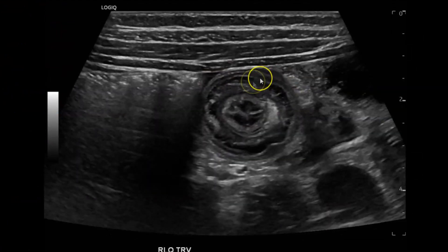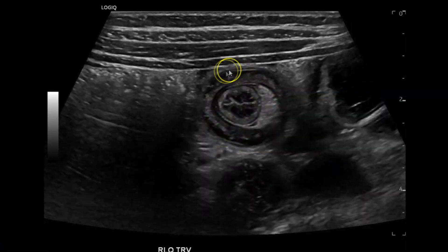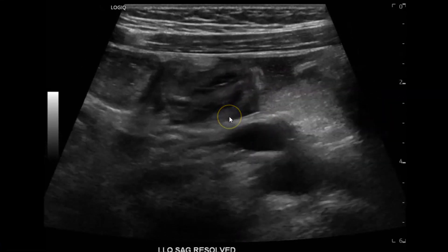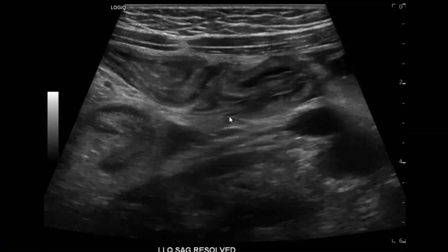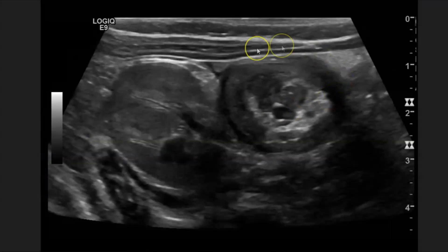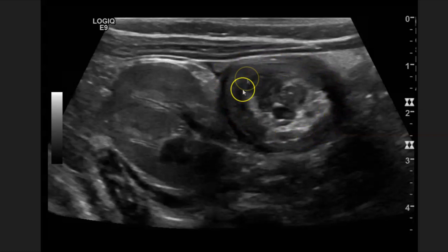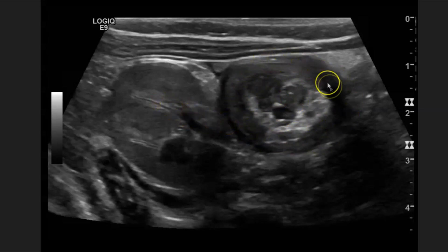As I've said in prior videos, if you ever see a target lesion in the left lower quadrant like that, it's most likely a small bowel intussusception. In the right lower quadrant also — if you see it and it resolves, it's a small bowel intussusception. Large bowel intussusceptions are usually about a mean diameter of 2.6 centimeters. Here's an example of an ileocolic intussusception in the right upper quadrant, which is usually where you will find these intussusceptions. In transverse, these target-like lesions are going to look like a bullseye or a target — you can see the right kidney and here's the colon wall.